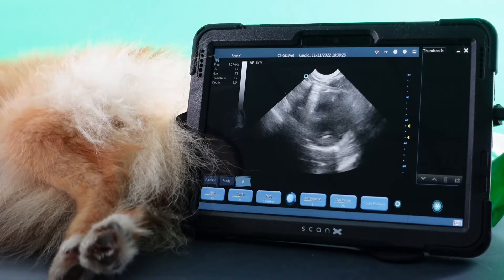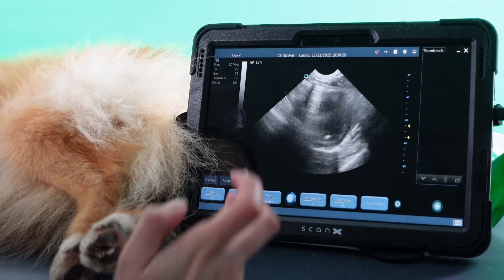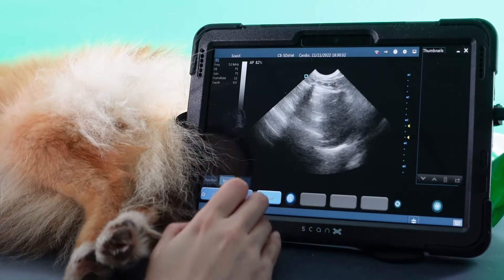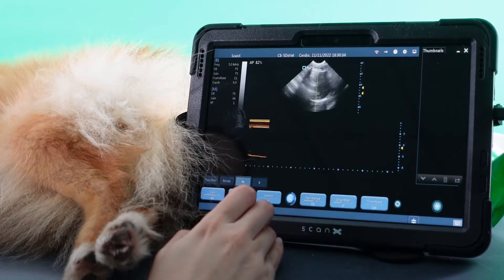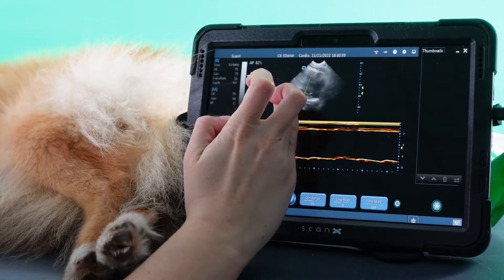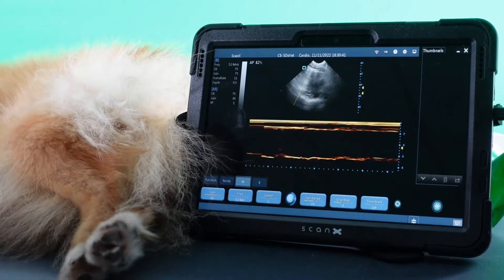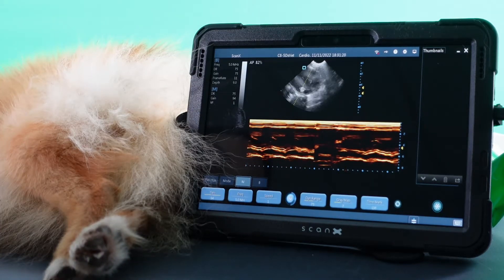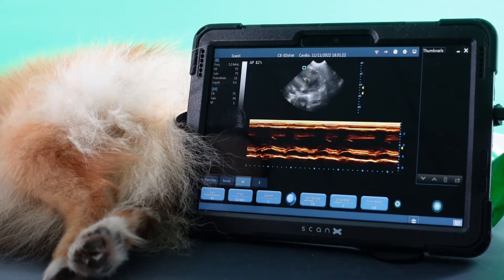For those of you who are big fans of M-mode, I'm going to try and do this with the wrong hand here. You click Mode, then B and M, and you can drag your cursor — it's usually going to be around here. You can obtain your M-mode trace.